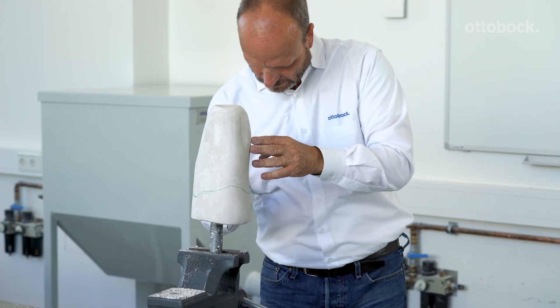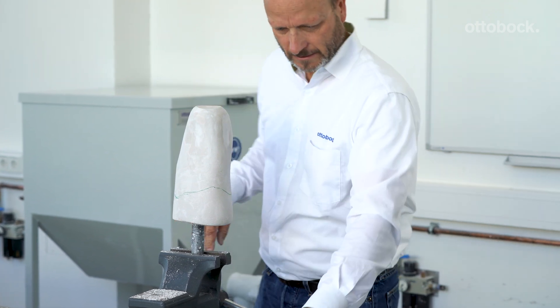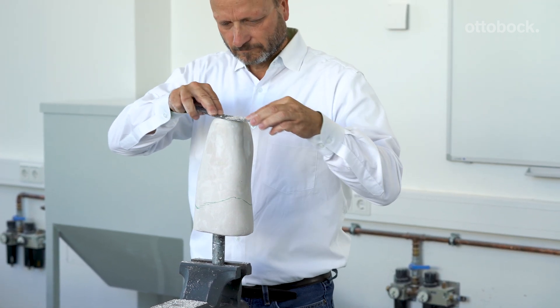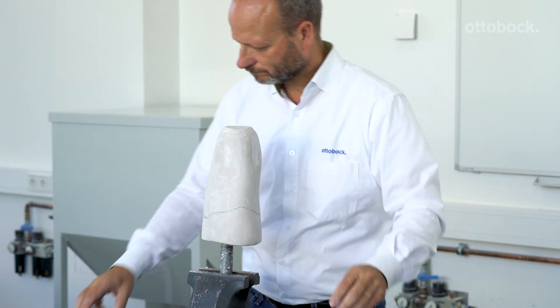The reduction in circumference, excluding the distal area, depends on the shape of the residual limb and the quality of the soft tissues. It is important that you flatten the bottom of the cast to receive the piston dummy and prepare it in the proper position.